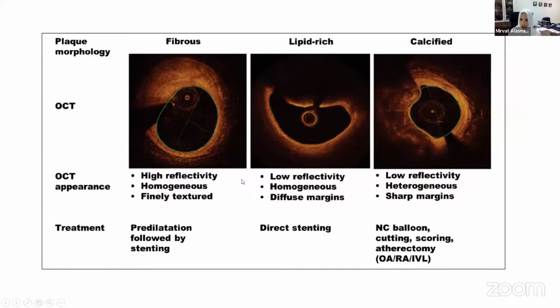But intracoronary imaging is about pattern recognition, so you need to see it again and again and again. It's a bit like when we were medical students, and then doing our medical residency and cardiology fellowships and looking at EKGs. You can read theoretically about EKGs and rhythm issues, but the comfort comes from pattern recognition, and so repetition, repetition, repetition, so you can start distinguishing between them.